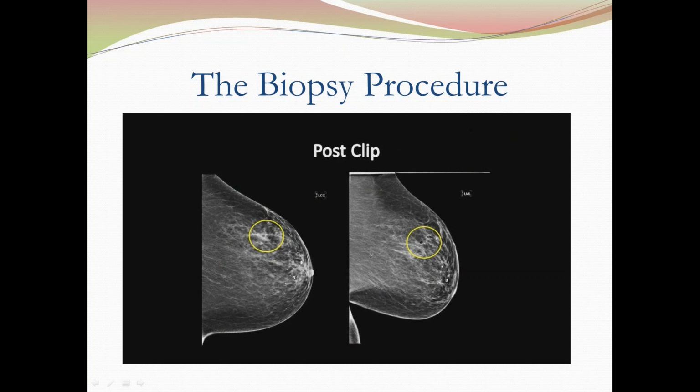I mean, the beauty of tomosynthesis is that when we do screening tomosynthesis, the recall rate is considerably less. It's about 1/3 as much. So that's a huge, decreased false positives is huge for us. That's one of the real problems in screening mammography. And the other thing is we're finding more invasive cancers.